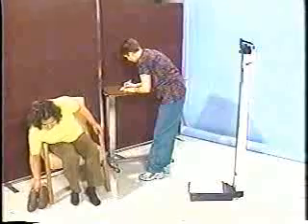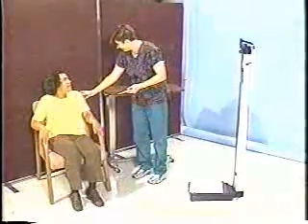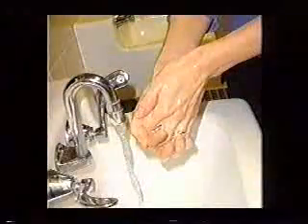Record the measurements on the appropriate chart record. Make sure to remove the paper towel. Wash your hands. Report to the nurse any deviations from the patient's original weight.